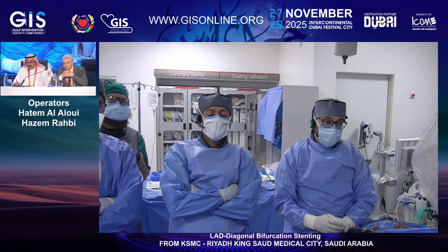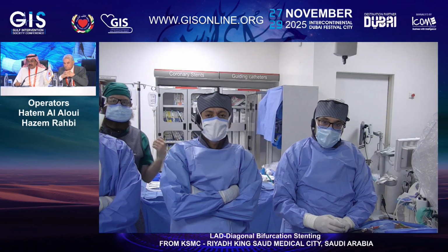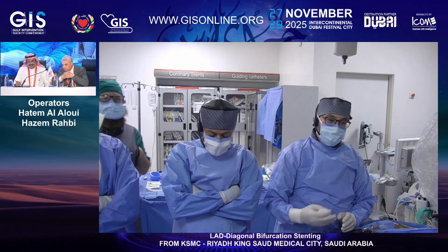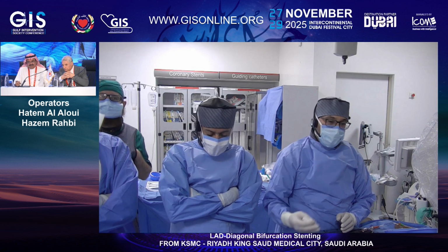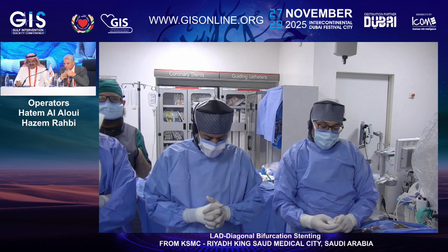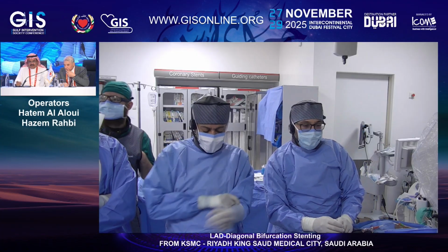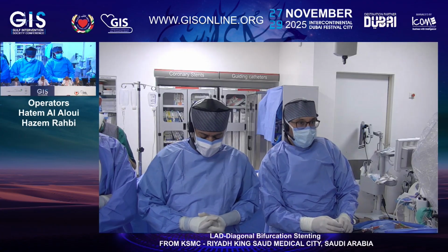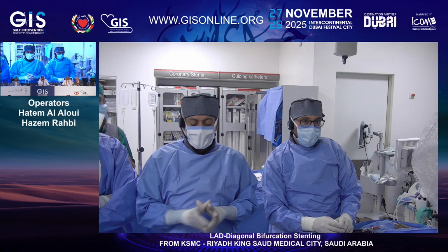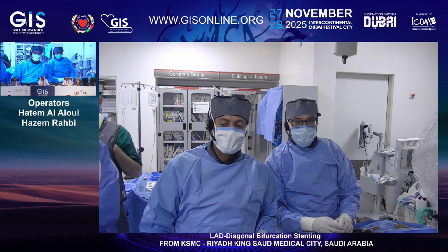We know that it will be very important to choose an appropriate length of the balloon for POT. I always have a tendency to undersize the balloons when I go angiographically, and whenever I do an IVUS, I find that the vessel is always bigger and it needs larger balloons. So I think the IVUS helps us to choose the appropriate tools to use in our procedure.